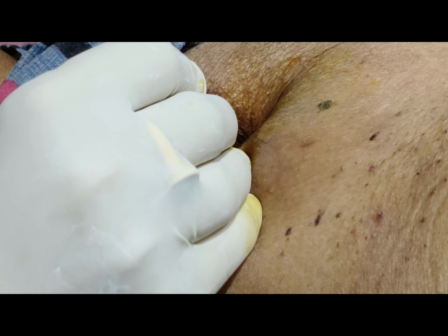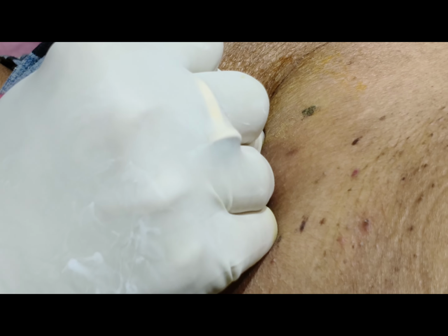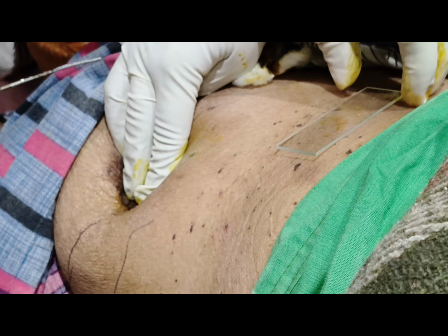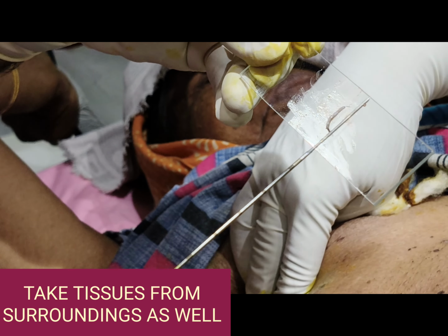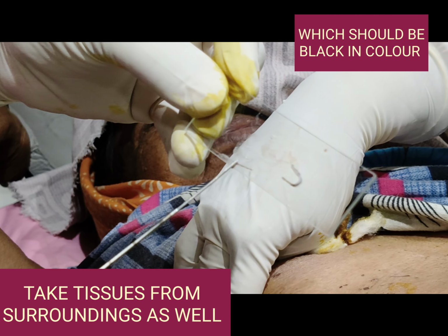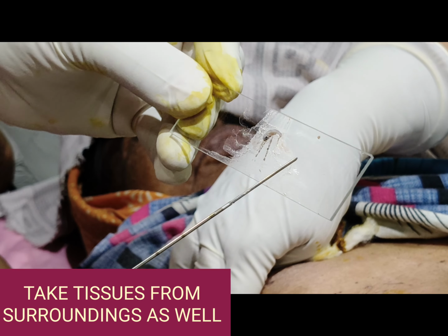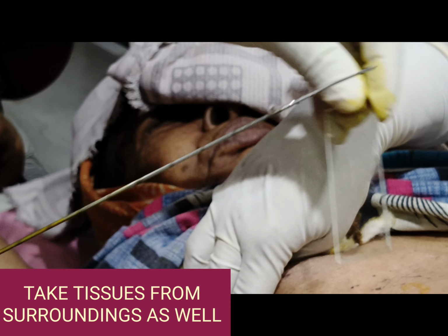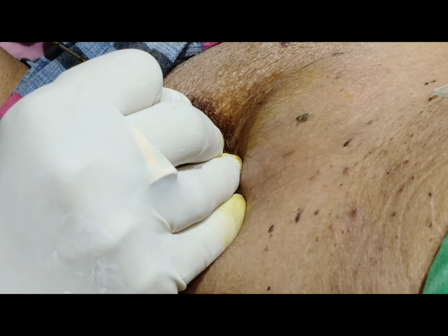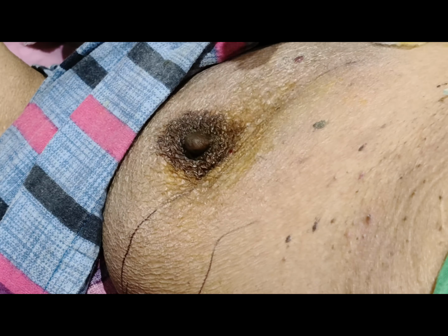We can see the tissues are coming gray whitish color and glistening, because there is fluid also. There is no blood in this case, no hemorrhage. We can see that tissue length is larger than the notch of the gun, because we know that the lung tissue is spongy. Whenever it comes out, it becomes expanded.